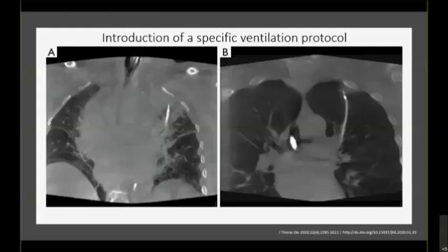These are patients with both left upper lobe lung nodules, and what you'll notice in panel A is that there is significant subsegmental atelectasis that completely changed the lung volumes. And then you can even have such significant atelectasis that you could actually obscure the lesion and you won't be able to see or visualize it no matter what platform you have.